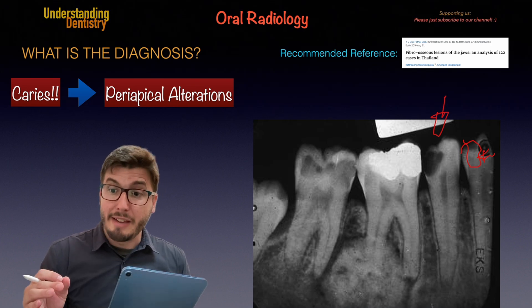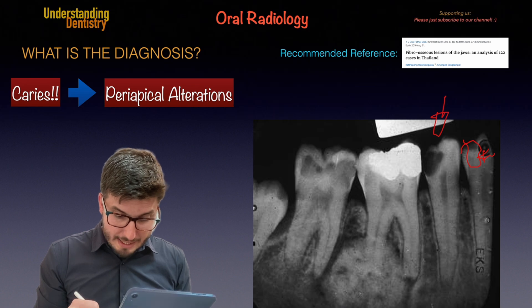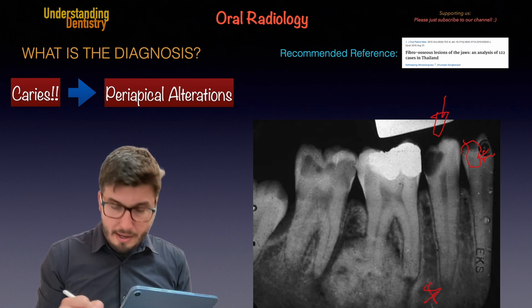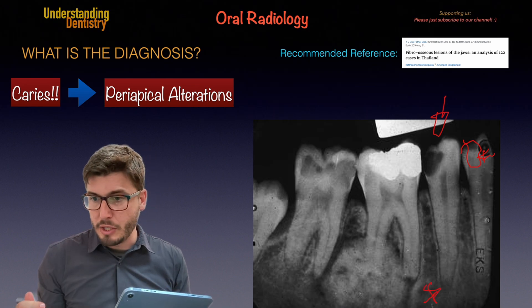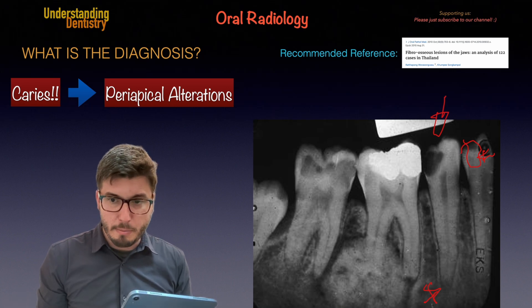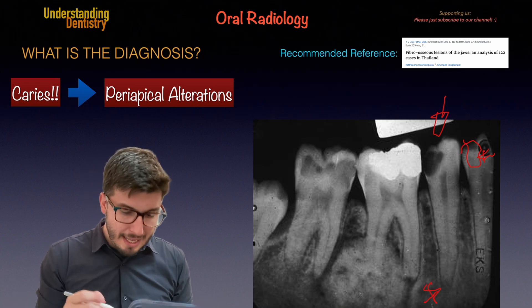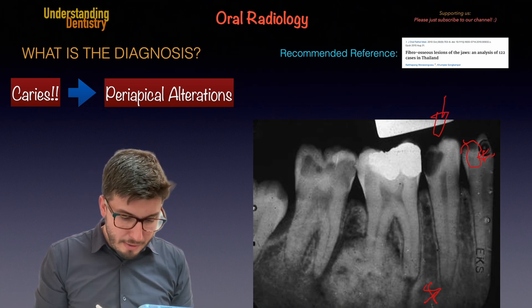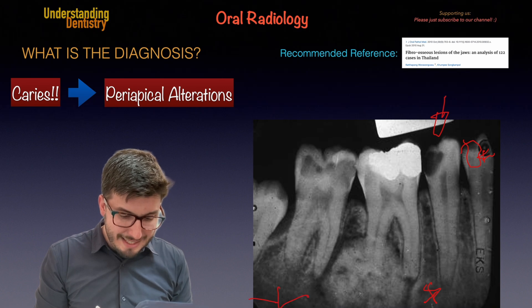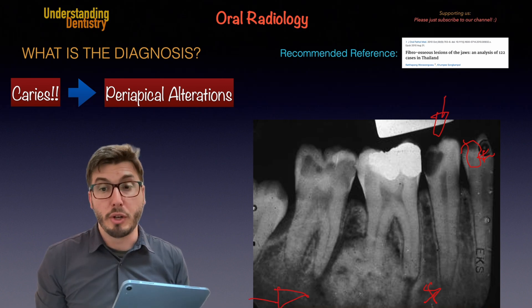We have periodontal ligament space widening. So let's understand that we do have periapical alterations here. Even in the first premolar we have this as well, and then our very big mixed periapical lesion.